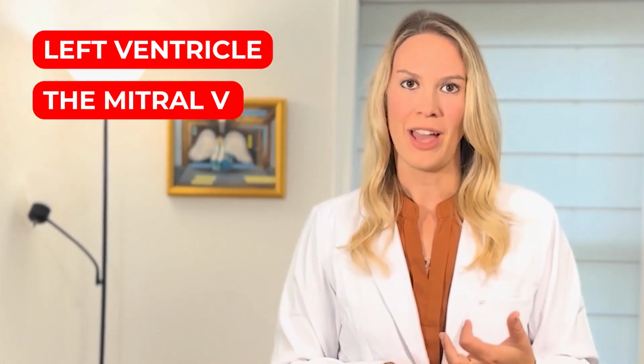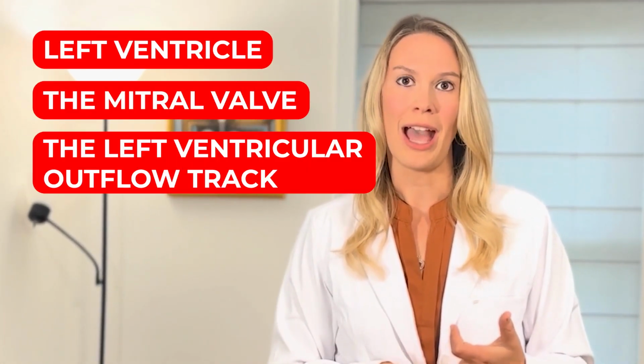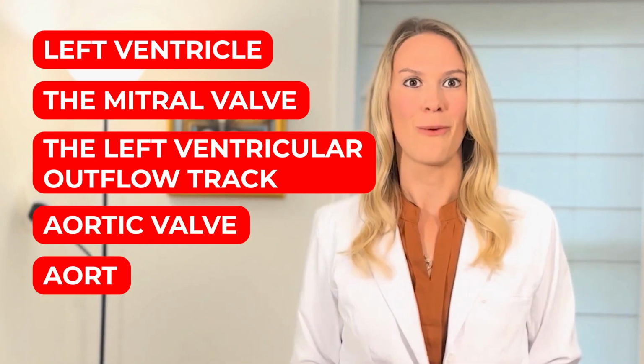And that's looking at your house or your heart from the side. You're going to see the left ventricle, the mitral valve, the left ventricular outflow tract. You're going to see the aortic valve. You're going to see the aorta. And you're going to really get an idea of the function of the heart, what these things are looking like.